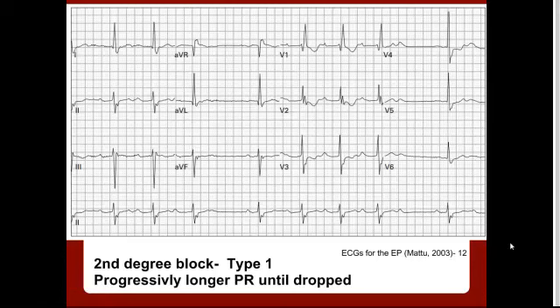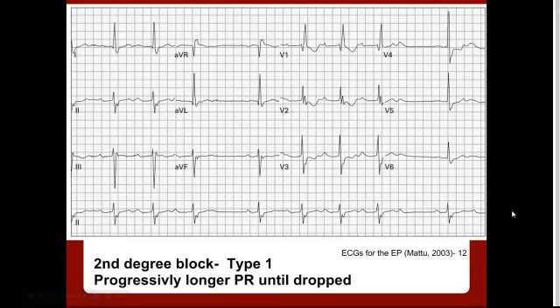In this example of a second degree block Type 1 — from case 12 in Mattu's book — you're going to have that progressively prolonged PR interval until you finally have one dropped. Going along the bottom rhythm strip: P, QRS, P, QRS. Here's the first interval. The second one widens up a little bit, the third one is even wider, and then finally you have a P with no QRS. Then it starts over again, starting smaller and gradually getting wider, until finally you have a P with no following QRS. That would be your second degree block Type 1, or Wenckebach.